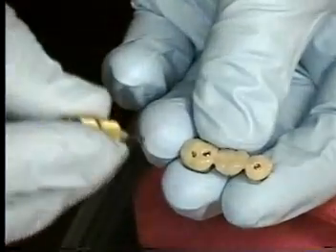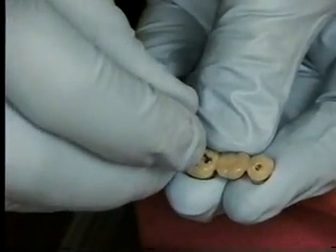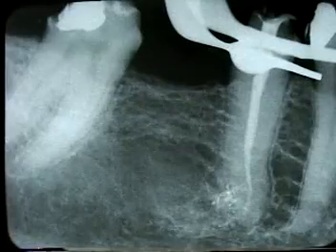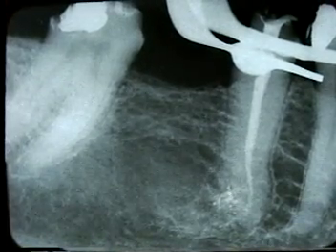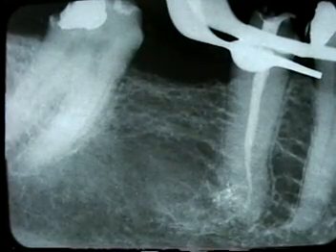Now you can see here I've taken a little metal lift key and placed it in that threaded channel, securing that opening. Here we have the finished picture of the endodontics done on the bicuspid, which was actually completed on a subsequent visit from this one that you just saw.